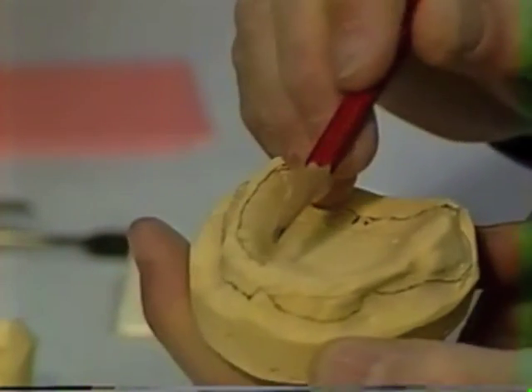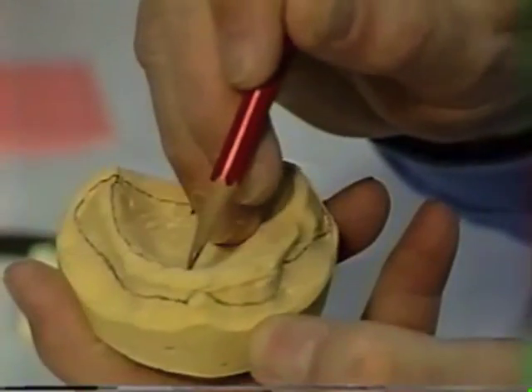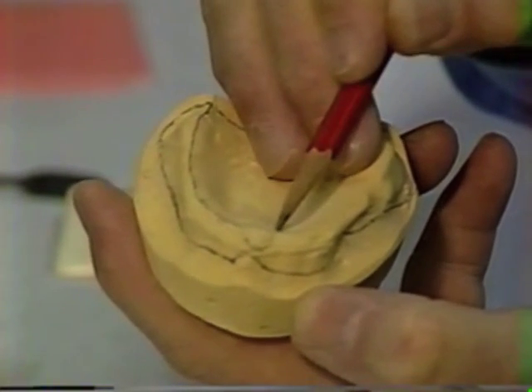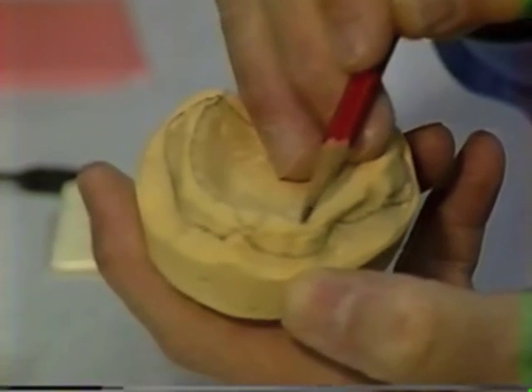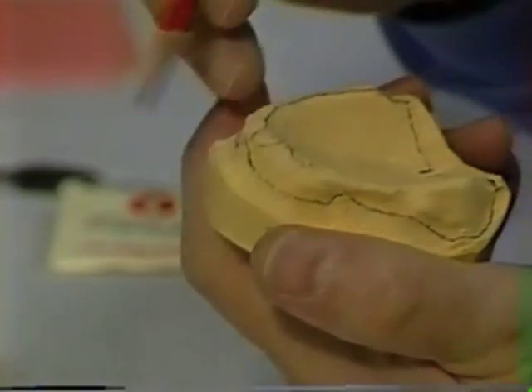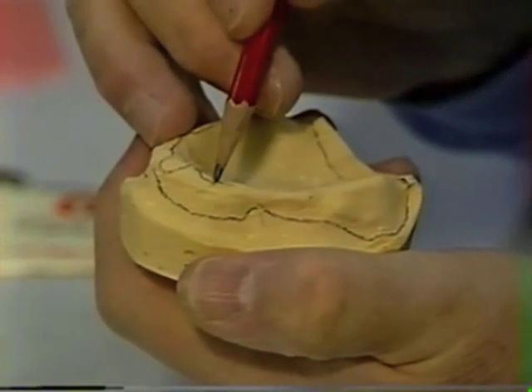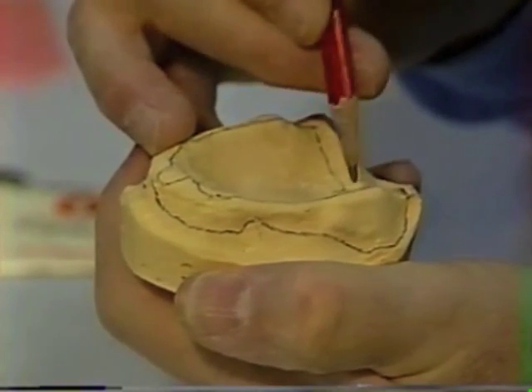And when we get around to the incisive papilla area, now here's the incisive papilla, we want to make sure that we skirt that incisive papilla and provide some relief over it so that when we make the tray and make the impression, we don't place pressure on the incisive papilla.